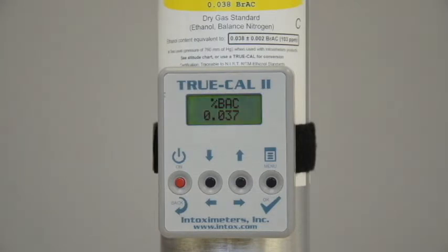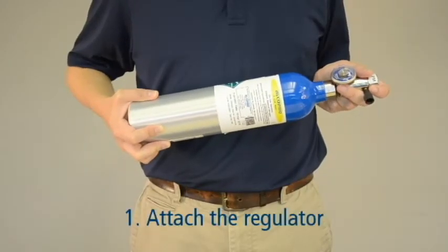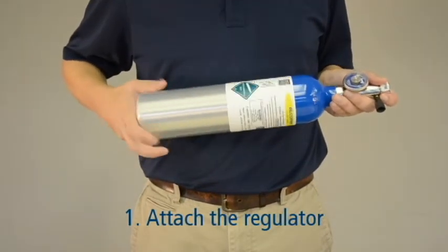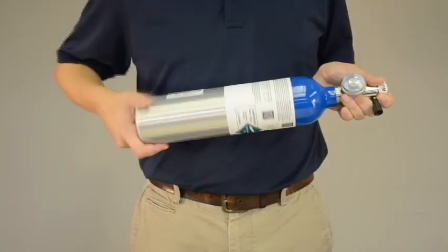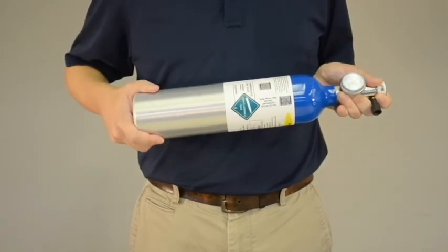Now that you know your expected gas value, you can proceed with a calibration adjustment. First, attach the regulator to the dry gas tank. For safety purposes, point the regulator end of the canister away from your body and away from others. Twist the regulator securely in place, making sure you don't over-tighten. You may hear a pop or a hiss sound as you tighten the regulator. This is normal.